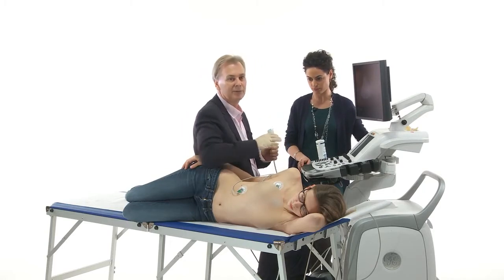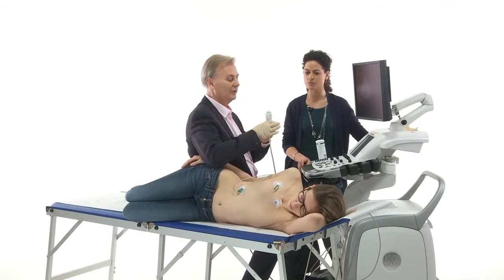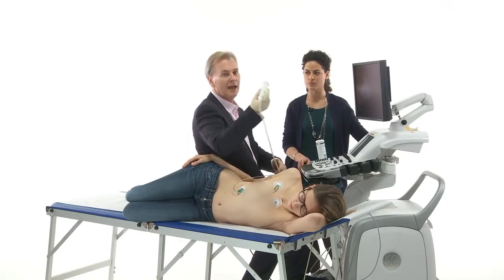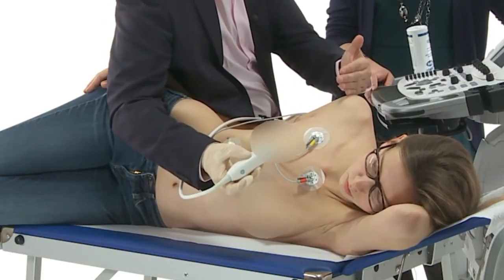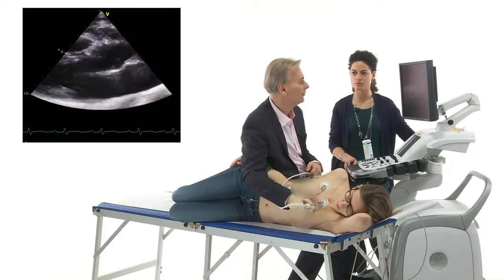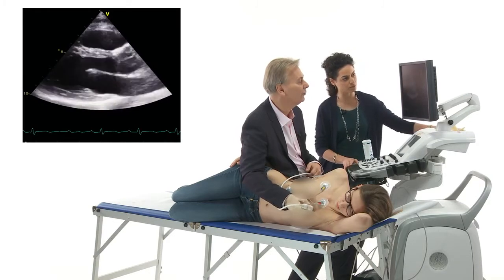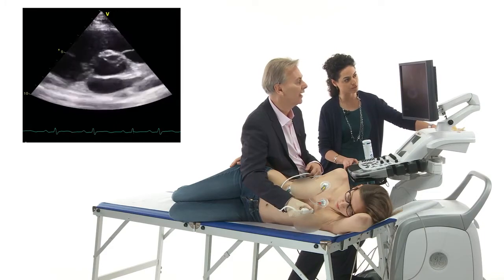Yes, I will use the same approach that you've already learned, where we use the parasternal window. Now, as opposed to looking at the left ventricle, however, we're now using a view which is a little bit more cranial at the base of the heart. How do we go about it? Again, we take our transducer and orient it to the right shoulder. So we're using the parasternal long axis view that we saw before. We put the transducer, get the parasternal long axis view, and then we simply rotate the transducer clockwise until we get a short axis view.